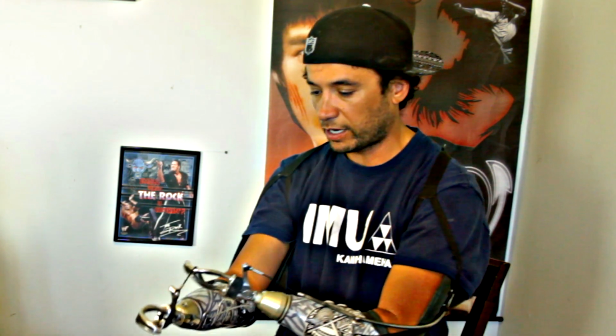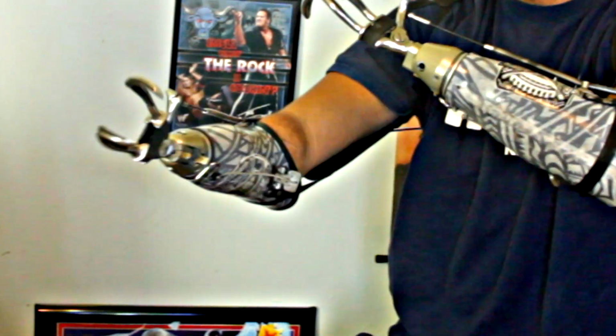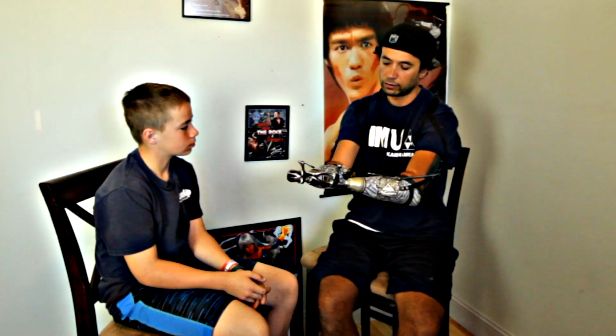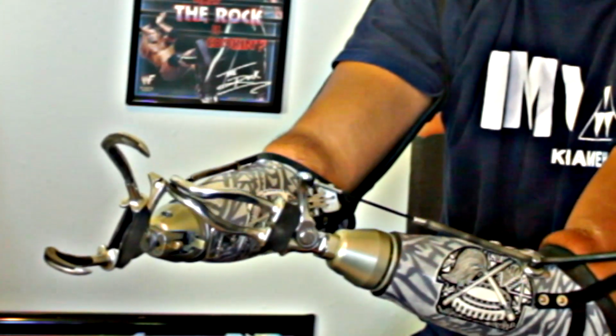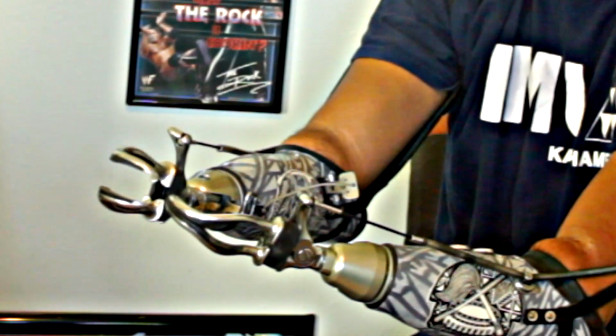So they have a little cable like this. The cable runs all the way around my back. My arm is pushing into this, what's called a socket. And then it's pushing against this, which causes this rope to pull against my back. So when I push out, the cable pulls this thumb open and these rubber bands are what pulls it back closed.